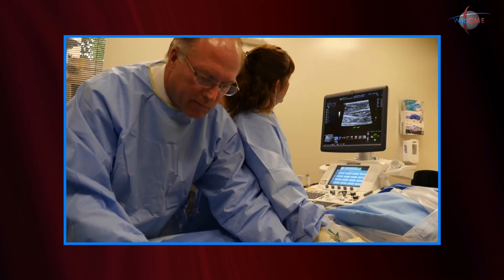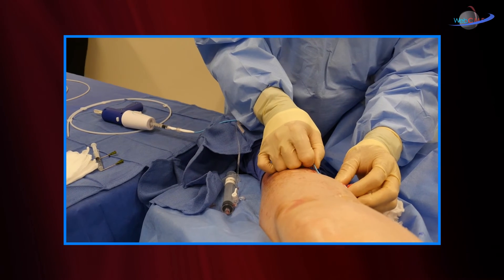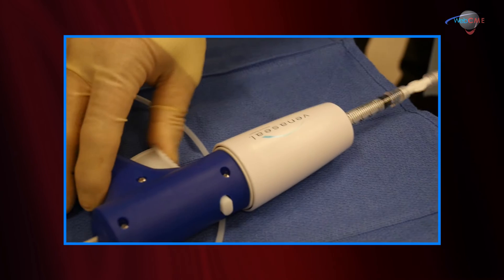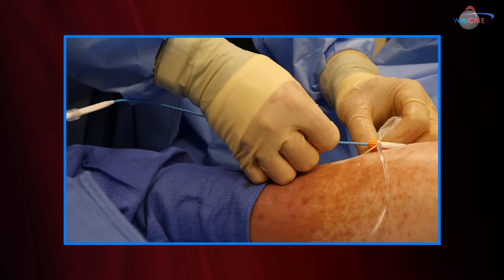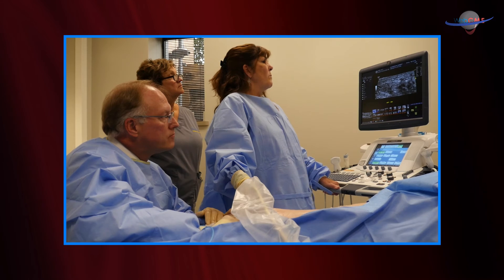When using venous seal, we simply treat a small segment of the vein by injecting a small aliquot of cyanoacrylate glue. We then hold pressure on that vessel. Near the groin, pressure is held for about three minutes, and then we serially treat the vein by slowly backing the catheter out, treating small segments of the vein and holding pressure for shorter periods of time — about 30 seconds.